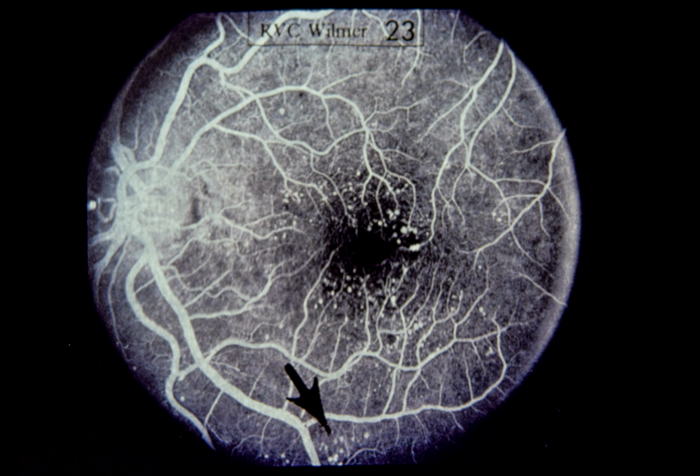for photocoagulation treatment. When photocoagulating patients with diabetic macular edema, we have found the fluorescein angiogram extremely useful as a precise guide to photocoagulation. We project a transparency of the angiogram onto a screen placed immediately behind the patient in order to facilitate extrapolation from the fluorescein landmarks to the patient's fundus during the actual photocoagulation treatment session.